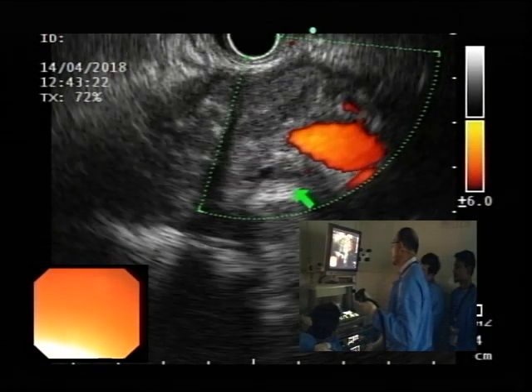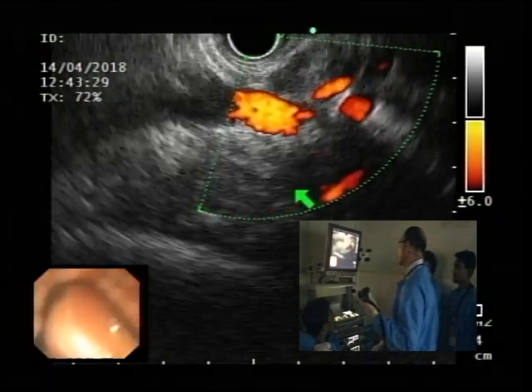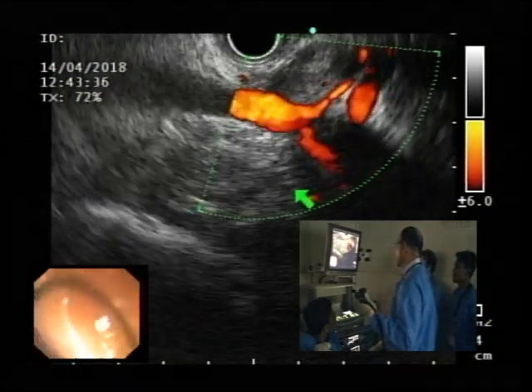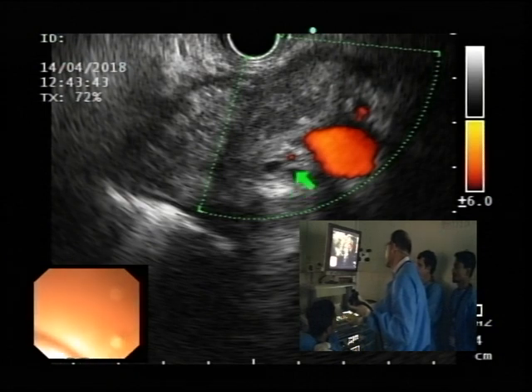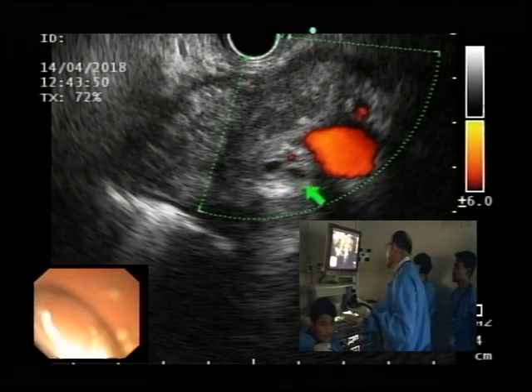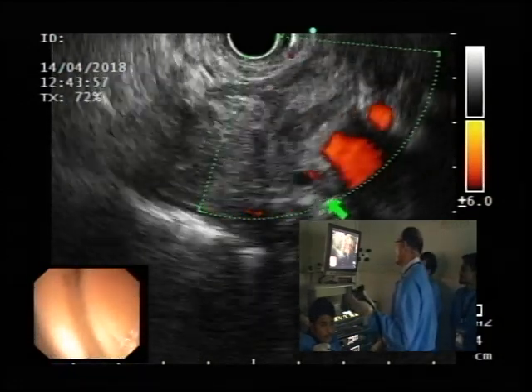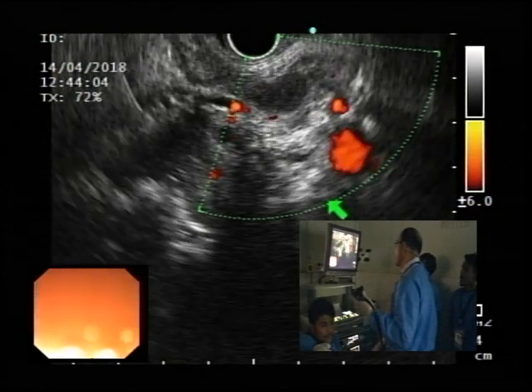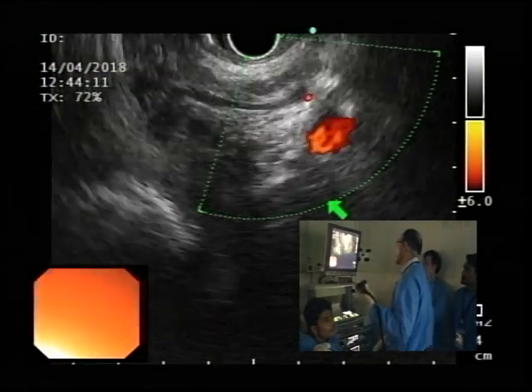So these structures here are ductal in nature. And as I go clockwise, I'm going towards the papilla. My sense is, and I could be wrong, that this is actually the bile duct, because it comes down this way, and then I'll show you the movement, then it comes back this way towards the hilum of the liver. If I go clockwise, it goes down to the right and you lose it a bit. But as I go counter, towards the liver, it's going towards the portal vein and not towards the pancreas. So I think that's his bile duct, as visualized from the stomach.